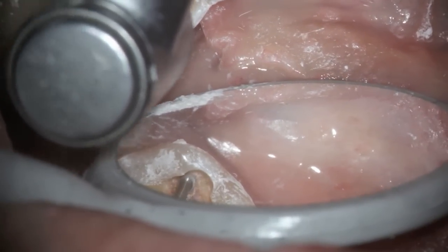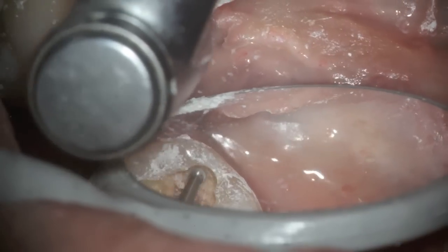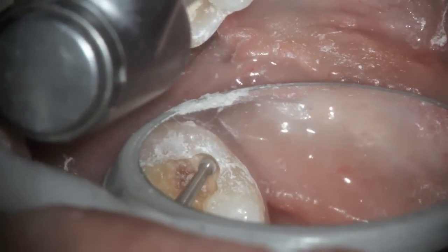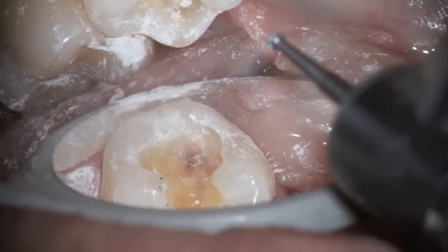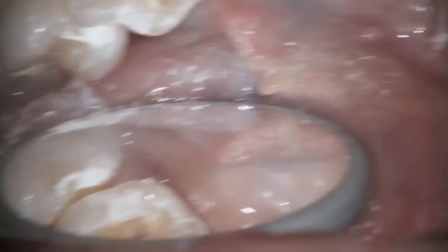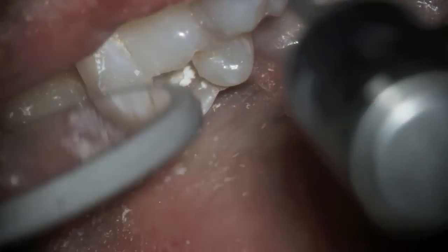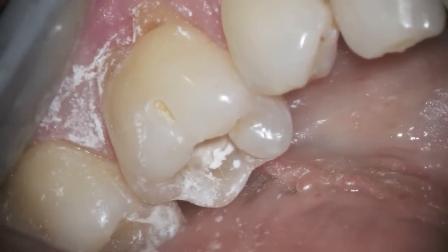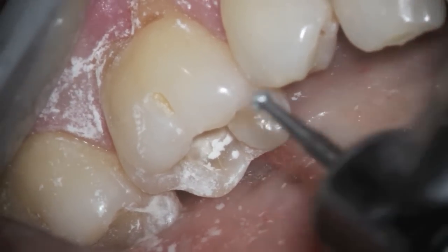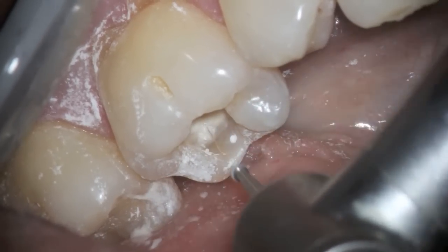Now, it doesn't mean that when something's brown it's necessarily a cavity. But when it's peeled away with a spoon and you know that it's soft, it should be removed. You can see the beginnings of that stress fracture as we look at the tooth on that right corner right there, so we're going to go ahead and remove the rest of it.